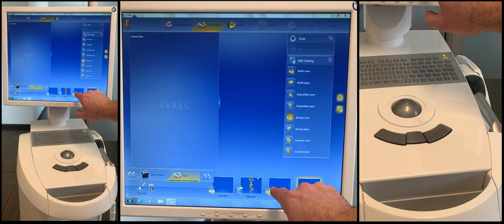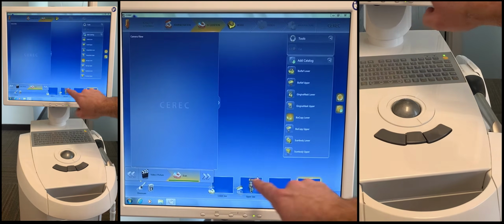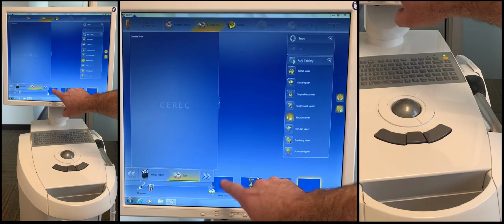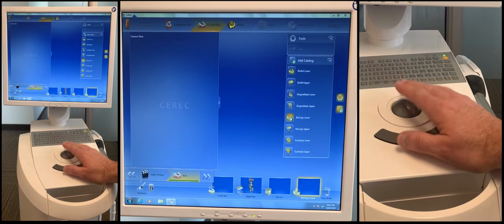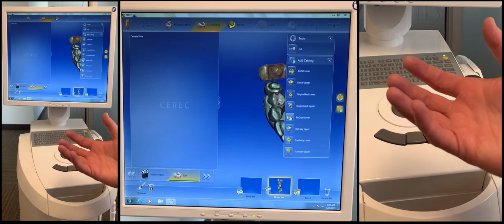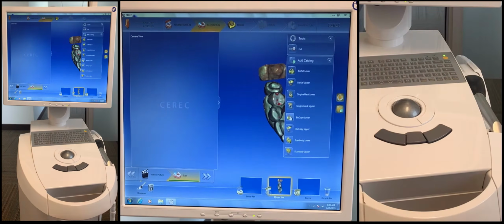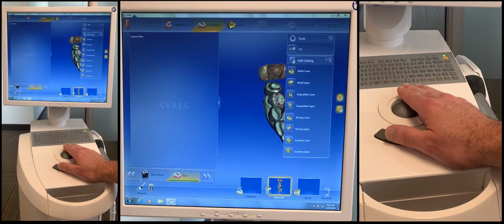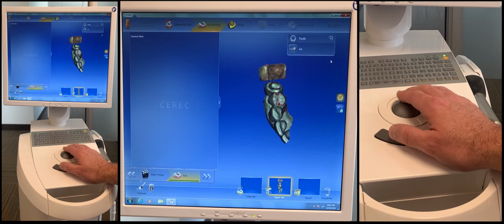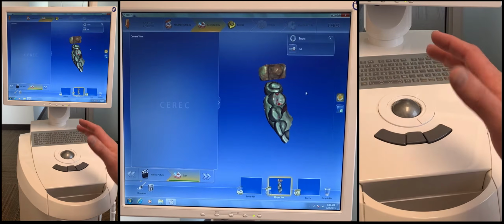And then if all three of these are filled, then I can move this one out of the way, move the lower to the upper, and then move that one back. Does that make sense? And then I can turn off that folder when I'm done with it. So basically you're using it as a holding folder temporarily while you're moving files around. So don't feel like you need to delete everything and redo it if you've moved them into the wrong folders.